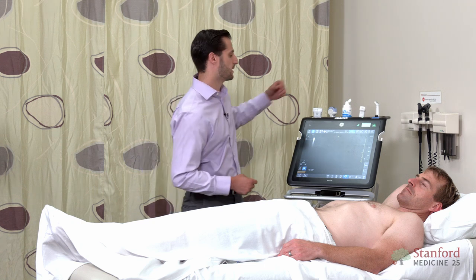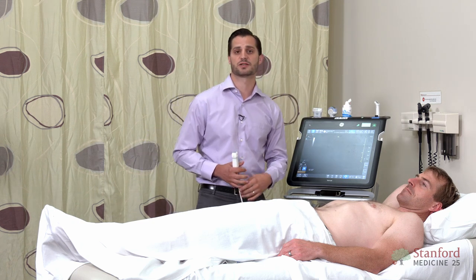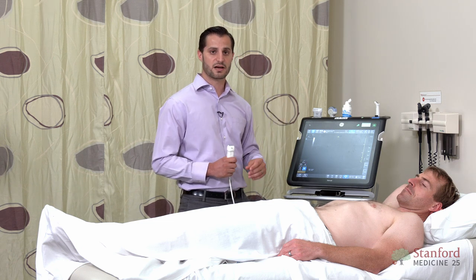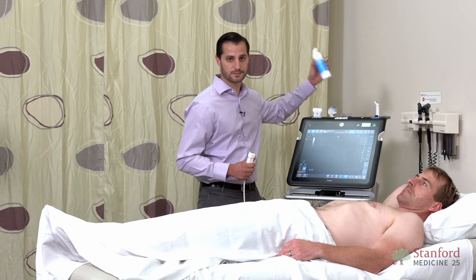To do this examination, you can use either a phased array or curvilinear probe. For this particular exam and demonstration, I'll be using a phased array or cardiac probe. You'll want to set your device to abdominal mode, which allows for optimal gain, depth, as well as frame rate. The dot is located on the left side of the screen for abdominal imaging.